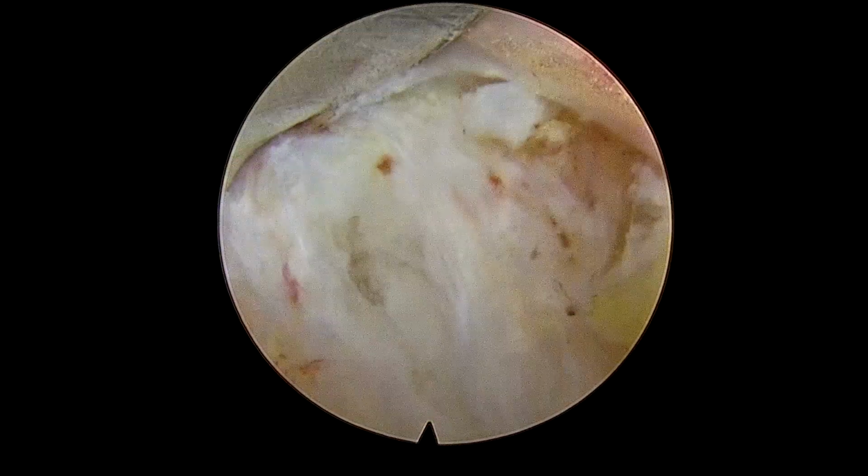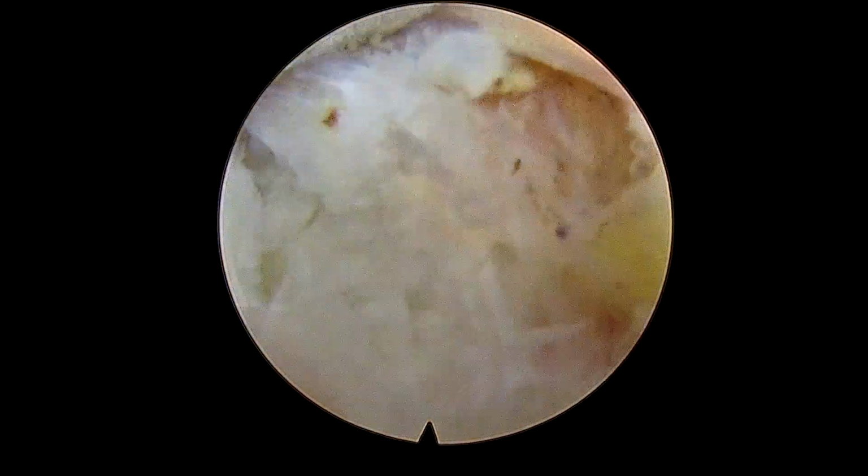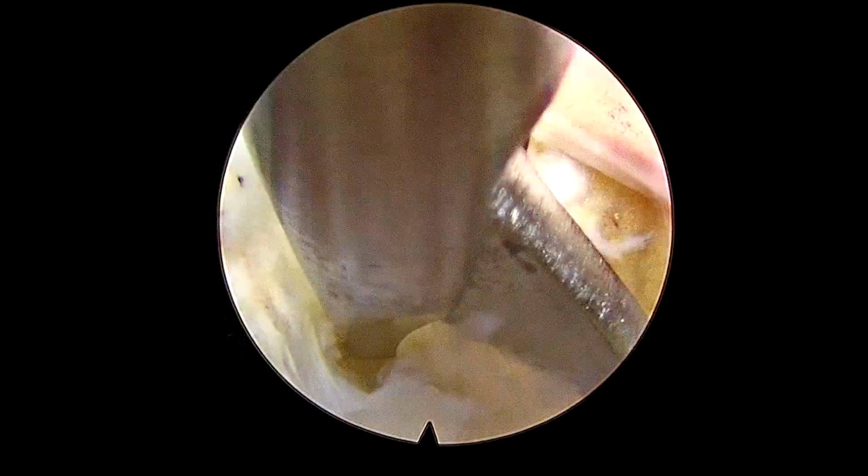So now you can clearly see this is the annular rent which we have created. So we'll just make it bigger, so that we can remove the free fragments from inside the disc. And I feel there is some central hardened annulus. I'll try to remove that part as well.